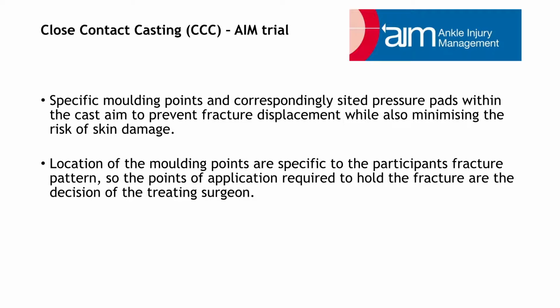The specific moulding points and correspondingly sited pressure pads within the cast aim to prevent fracture displacement while also minimising the risk of skin damage. The location of the moulding points are specific to the patient's fracture pattern, so the points of application required to hold the fracture are the decision of the treating surgeon.